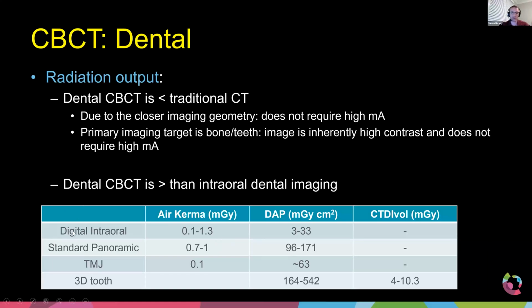So we're going to compare a digital intraoral. And I know there are film intraorals that are still being used quite extensively here in the US, and I know in Thailand and probably all over the world. Film intraoral is still a little higher dose than digital. So for what it's worth, I only had access to digital systems, so my measurements are probably going to be lower if all you use is film. But know that film intraoral is still lower dose than dental CBCT. So I just had to make that statement.